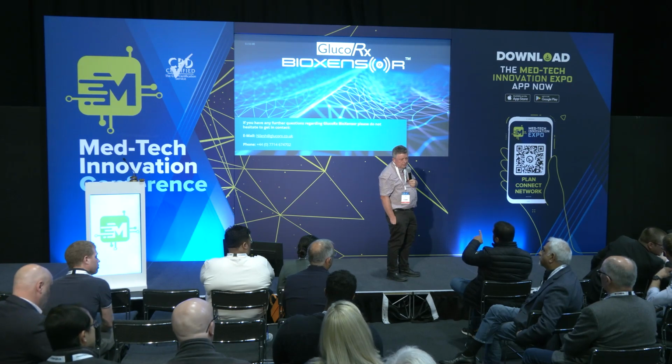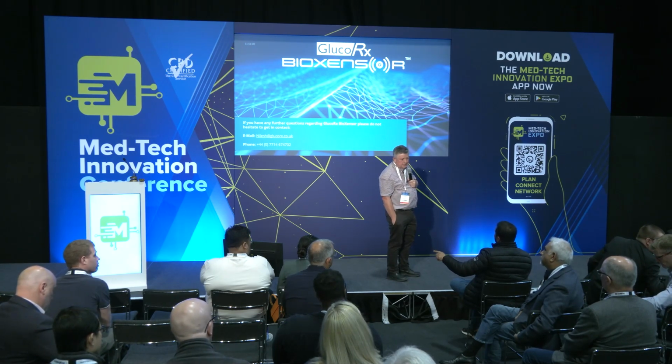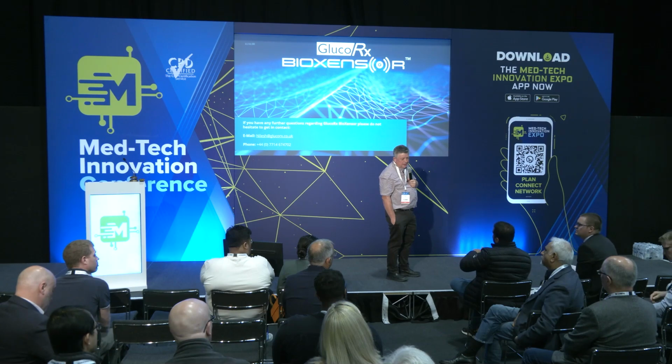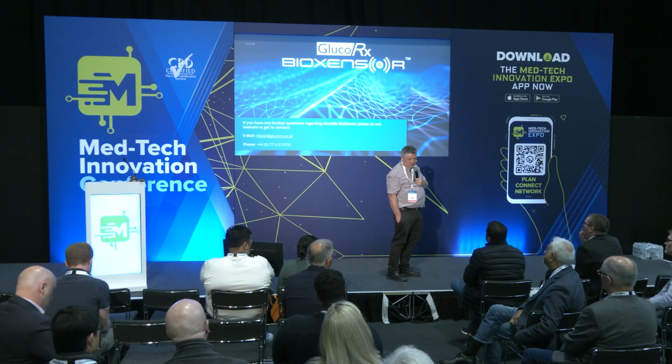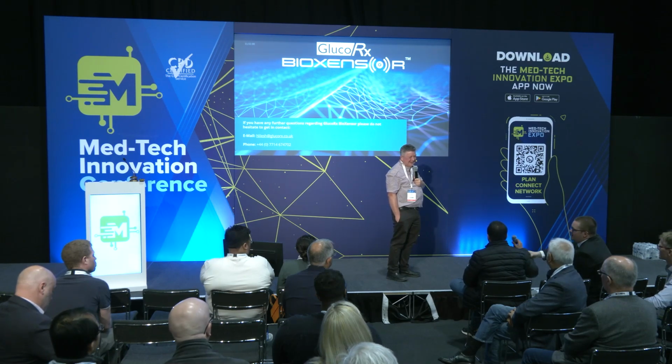So when you look at it with the same device, it's possible that because of the dielectric properties of the kid, you can absorb more energy. You're going to see a different chunk as compared to the adult. So how do you differentiate between them? Well, that's why we don't just use RF. We're not pinning all our hopes on RF. Okay. Thank you.